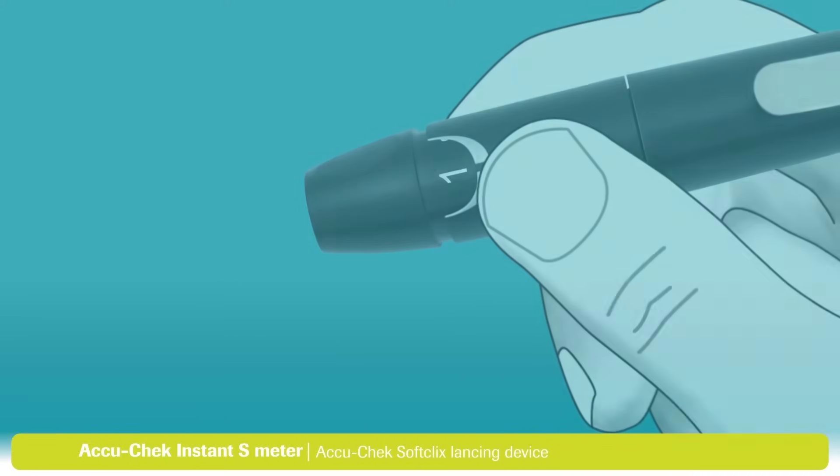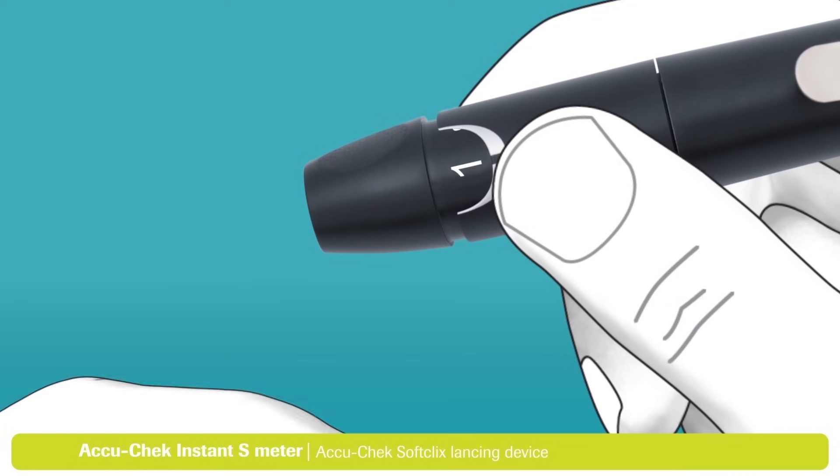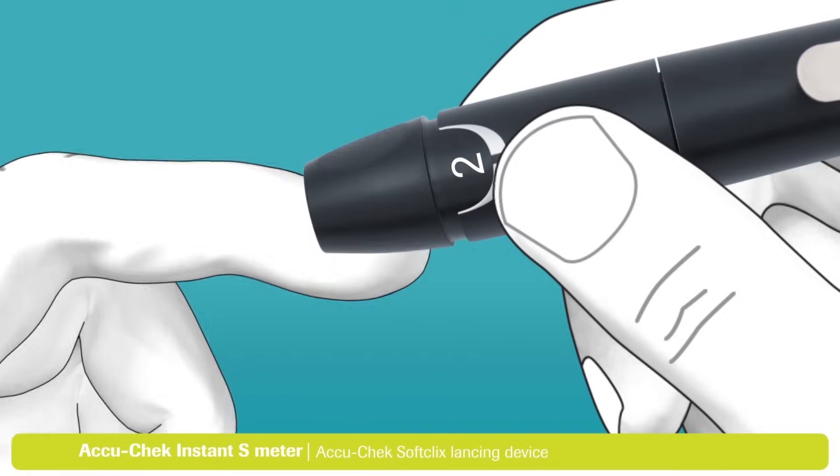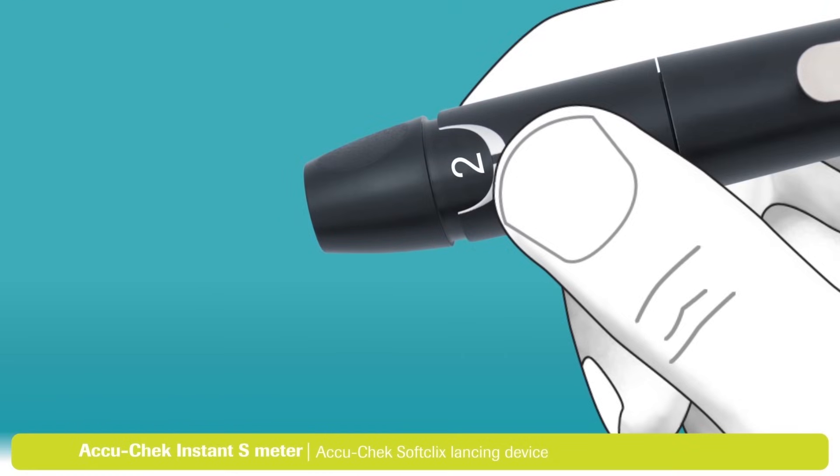The next step is to set the penetration depth to match your individual skin type. By turning the dial on the cap, you can select the depth of the lancet. Set the dial to 2 to begin with. You may need to adjust the setting a couple of times until you find the right level for your skin type.